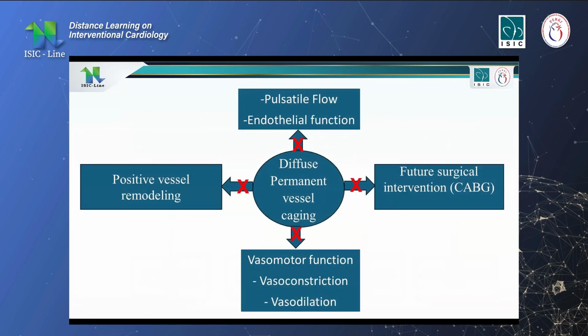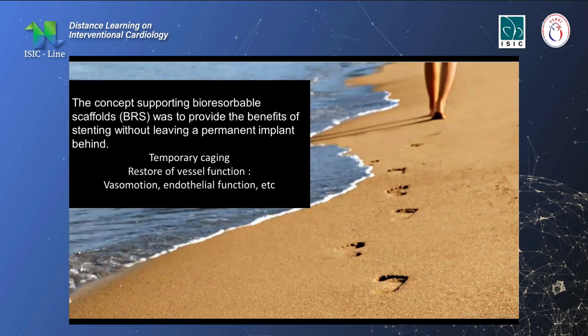If we implant stents, the more stents we implant, the vessel will lose the vasomotor function, positive vessel remodeling, pulsatile flow, and of course, future surgical intervention if necessary. Next. So the concept of BVS is to provide the benefit of stenting without leaving a permanent implant. Therefore, it may offer a positive impact in terms of restoring vessel function.